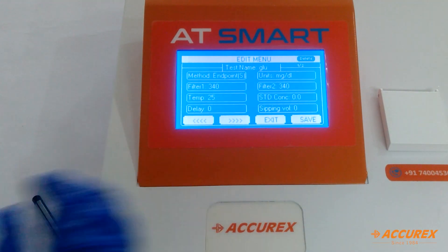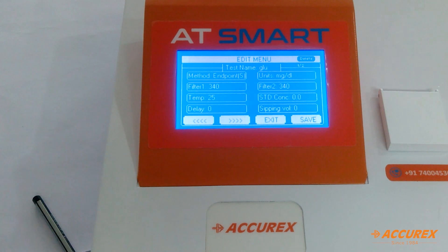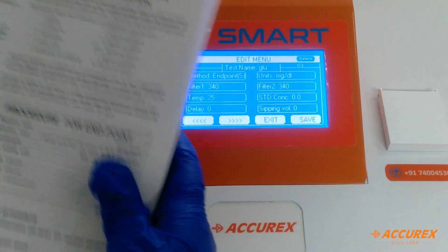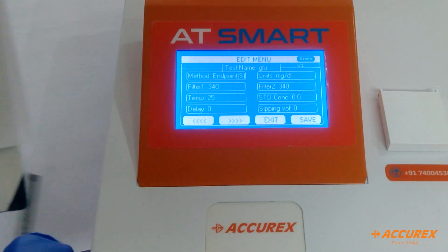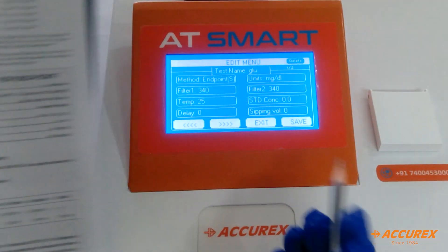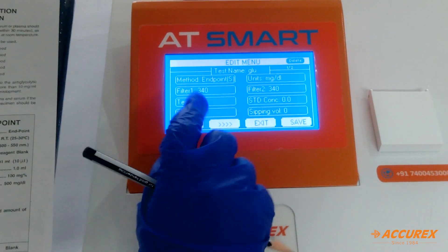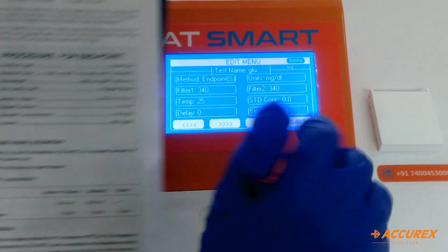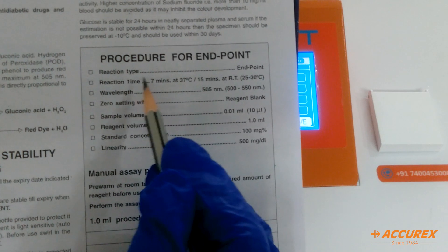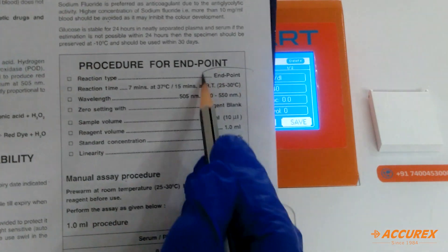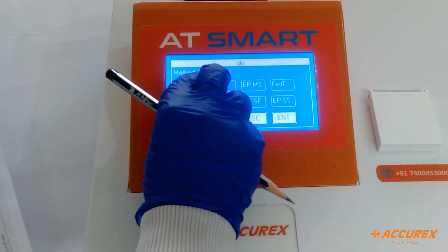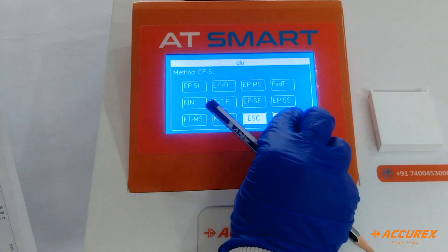For other parameters, we will refer to the pack insert. First thing is endpoint — so reaction type is endpoint. Enter endpoint and save.